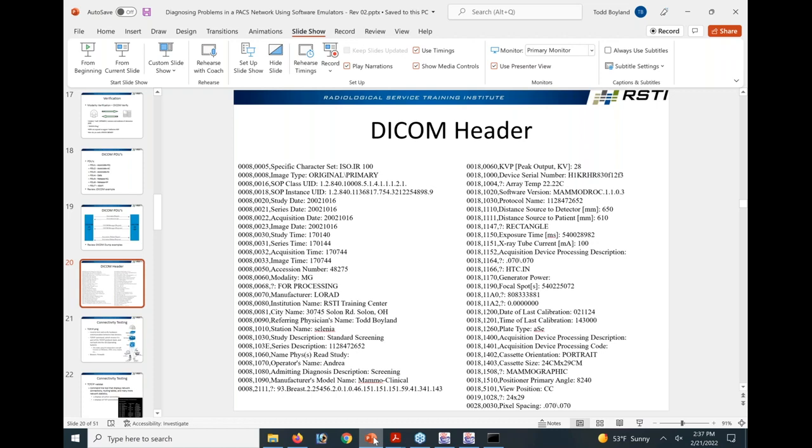Instance number, but there's a DICOM tag up here somewhere that's called instance number, and it was empty. And the PACS said, I can't do that. They rejected this image for that reason. But my point is, it tells you that. I know you wouldn't have known to look here, but the whole point of this is understanding these PDUs.